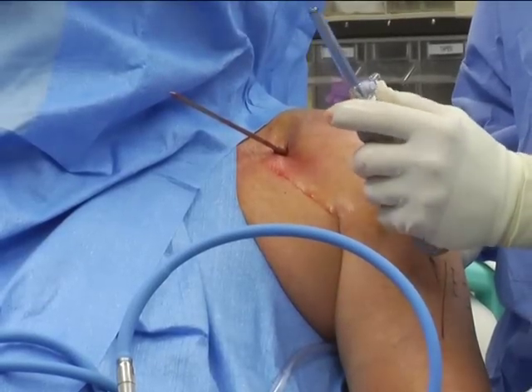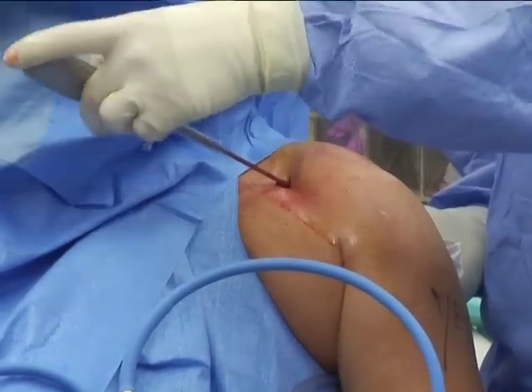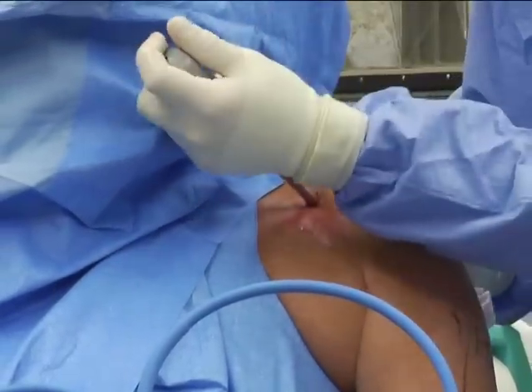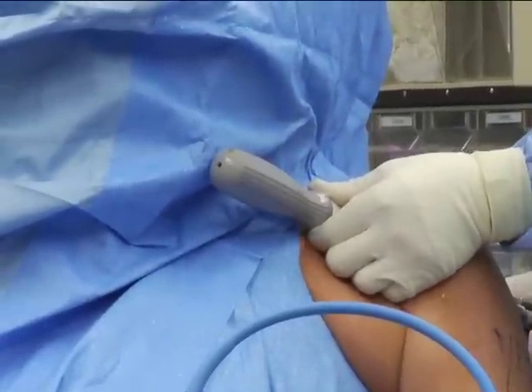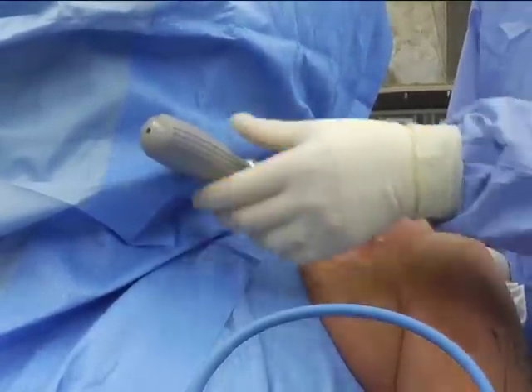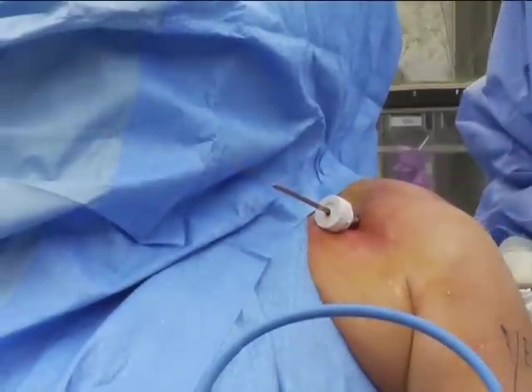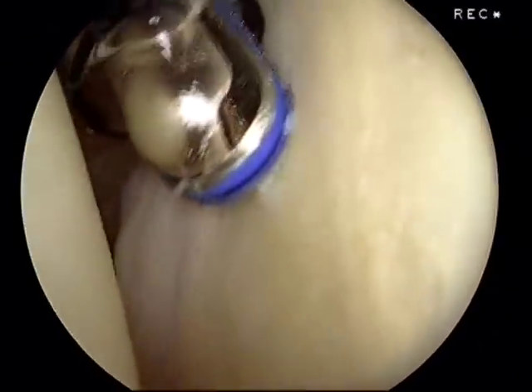We use a cannula and an introducer that's cannulated, with a line-to-line fit. Slide it right to it and then just reverse the motion. Now we're in the joint — I'll push my cannula back in holding the arthroscopic cannula. Take out the switching stick. To the left is the humeral head, to the right the glenoid.